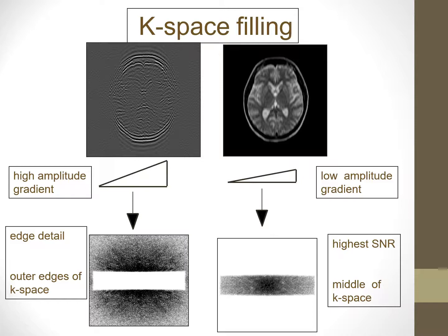When we're doing our angiography exams, one of the things we do have to consider is our K-space filling options. So let's take a look at those.